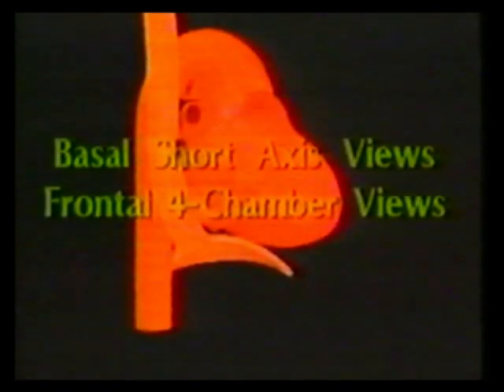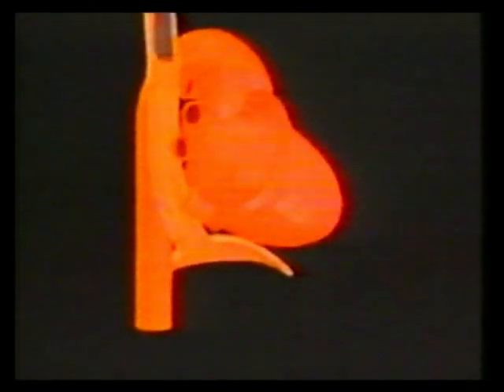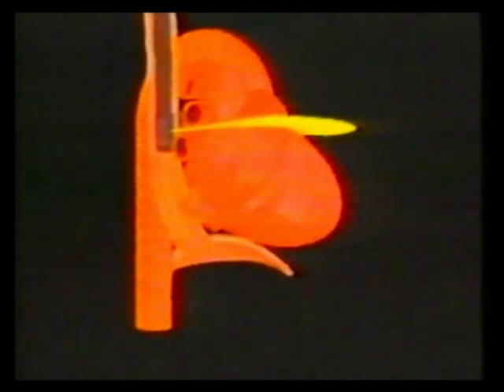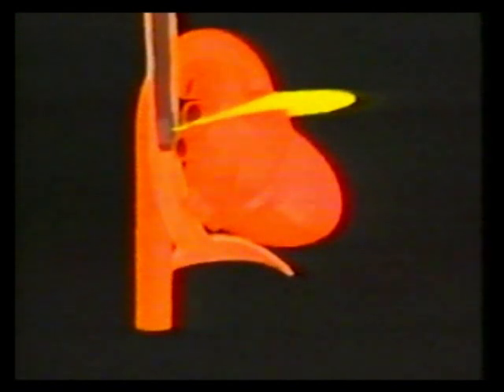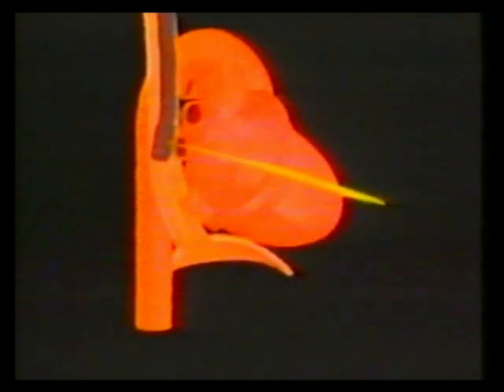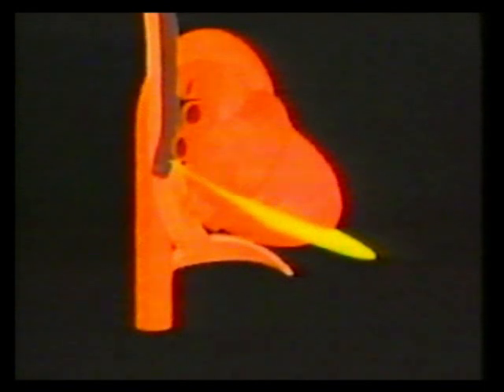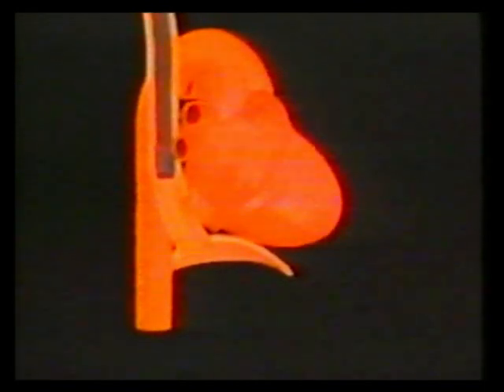The transesophageal examination usually begins with basal short axis and frontal four-chamber views. The scope is advanced into the esophagus approximately 25 centimeters. In the horizontal plane with progressive anteflexion of the transducer, short axis views are obtained, also by slight withdrawal, views of the pulmonary artery. With retroflexion of the scope, frontal four-chamber views are obtained. Advancement of the scope assists in these views.